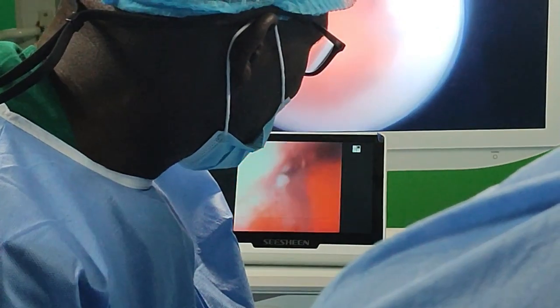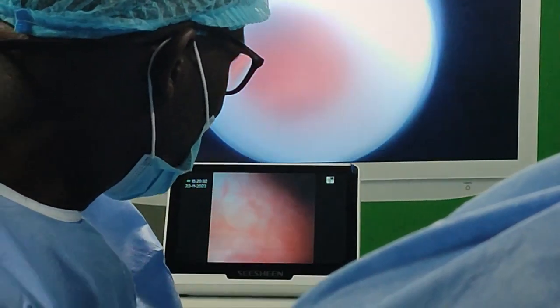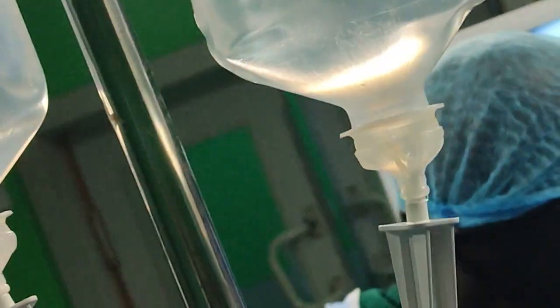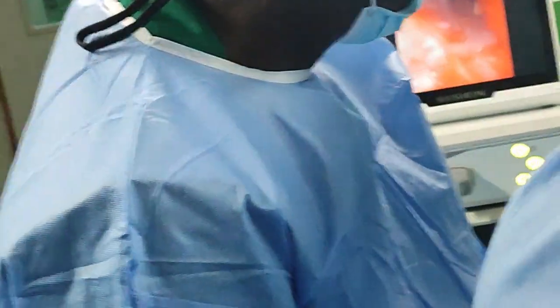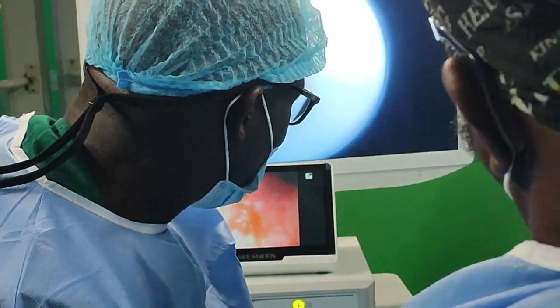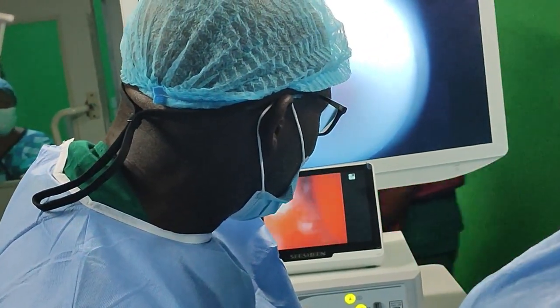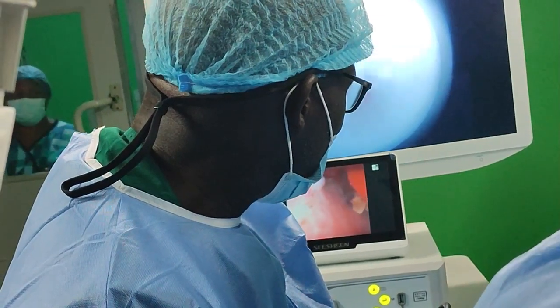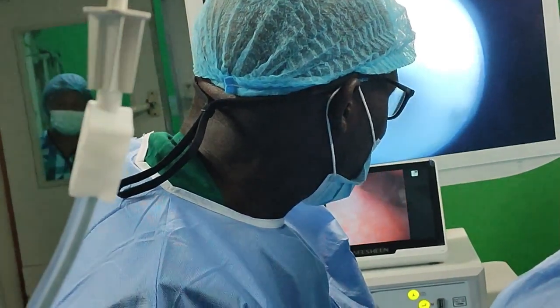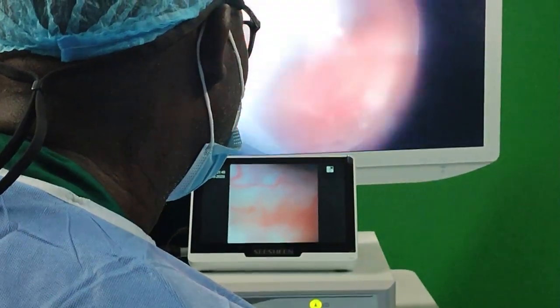Basket, or Gabelo, just scrub, come and help him with the basket. Yeah. Don't put too much pressure. Yeah, this is a single part practice. That's very good. With this one, you are sure of 100% clearance on the table. Would you go and remove it now? Bello, check. Works in this case.